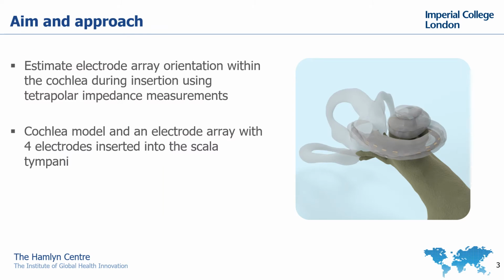In this work, we want to tackle the problem of lack of visual feedback. For this, we intend to provide the surgeon with a tool that allows him to estimate the orientation of the implant within the cochlea during insertion using tetrapolar bioimpedance measurements.